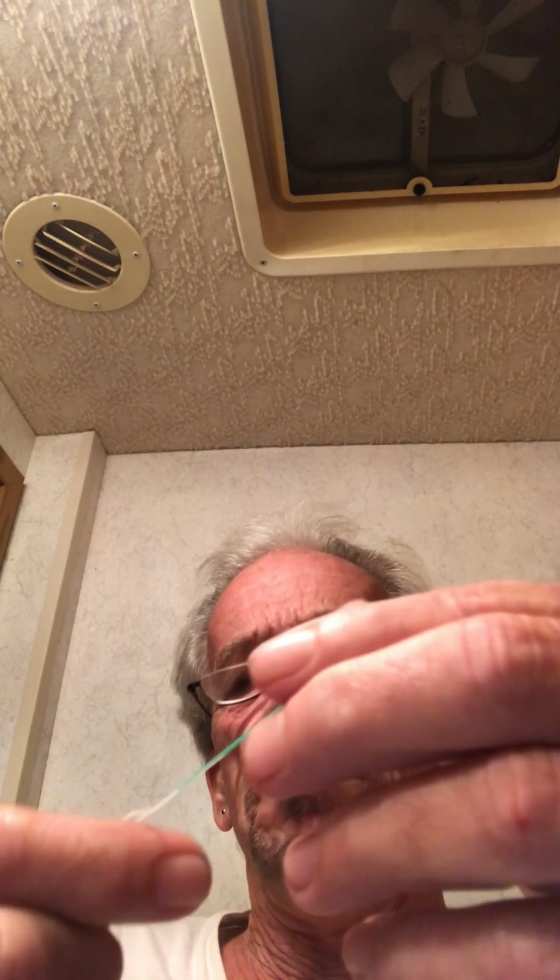Alright. Am I trying with the right one? No, I'm not. Wrong side. See, that was a little bit fatter, because that's two pieces. That's both ends of the floss. This is the threader. I was trying to push the wrong end in, and it was twice as thick, so it wouldn't go. Let's see.